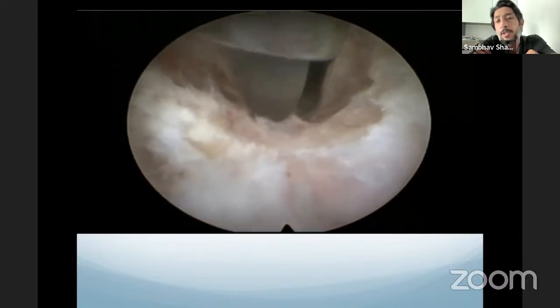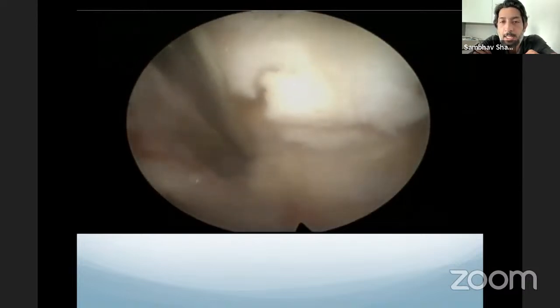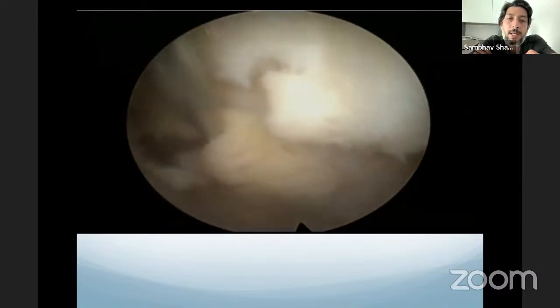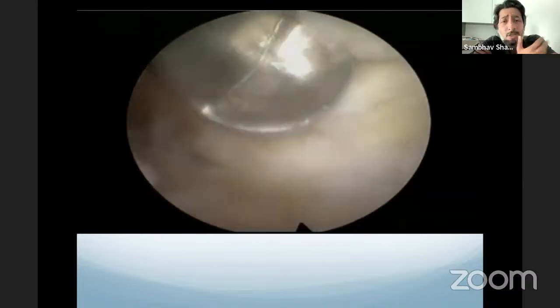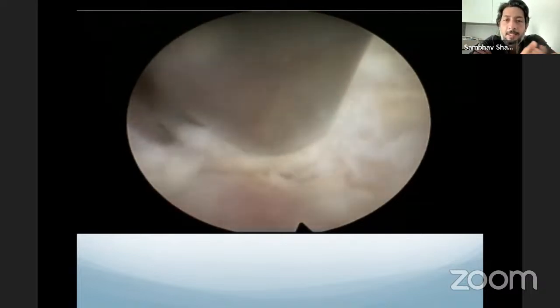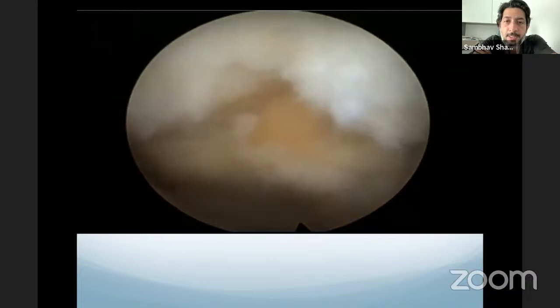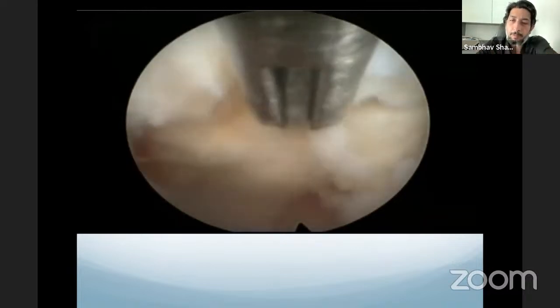This is the oval burr with a front and a lateral hood. So this protects your neurovascular structures medially and inferiorly. And here I'm trying to now free the flavum from its attachment. So you can remove the flavum piecemeal, you can remove the flavum en bloc. I mean, it's absolutely your choice. However, I would say finish all the bony work before removing the flavum.